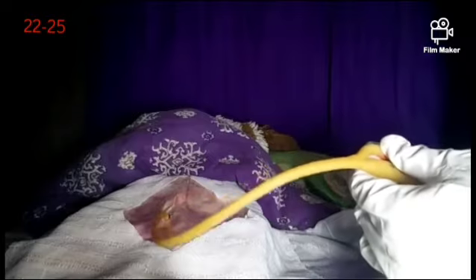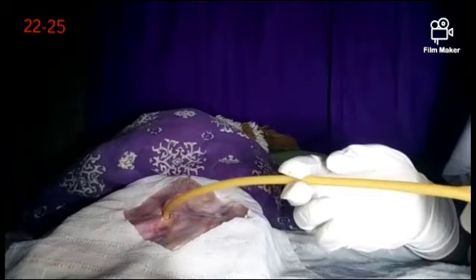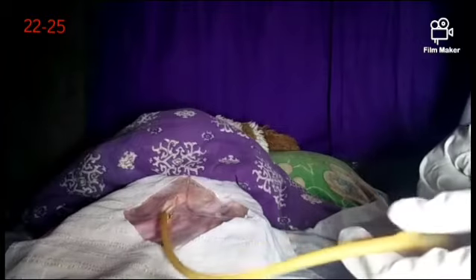The rationale for this is to create a balloon to ensure catheter retention and maximize continued bladder drainage. Proper attachment prevents trauma to the urethra and meatus from tension on the tubing.